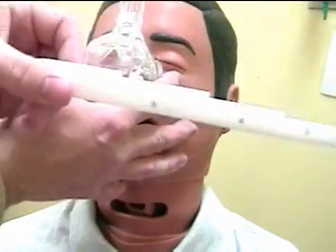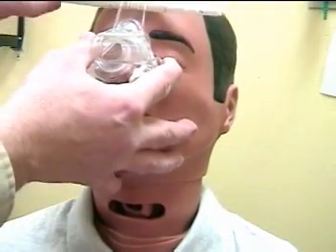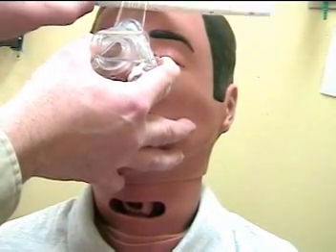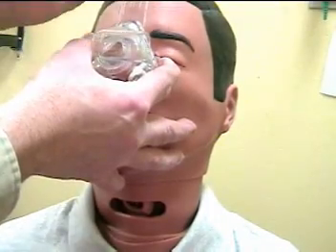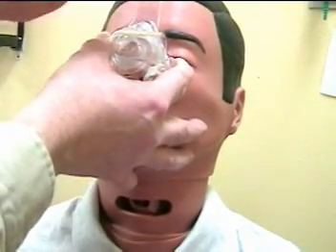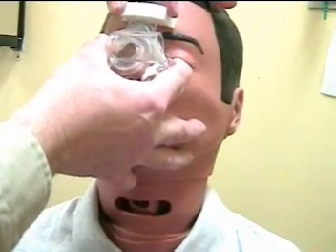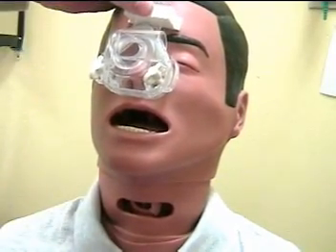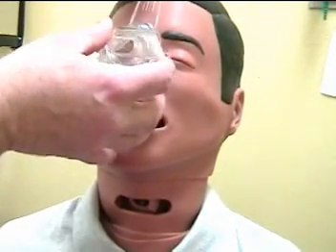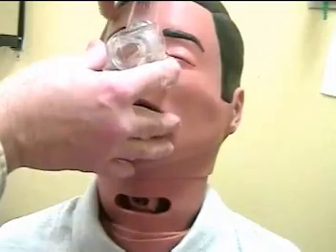This little sizing block helps tell us how far this block should be, and you try and make sure that the mask is level, and then you find which level of the block fits the best, and in this case it's the level 6. That refers to the spacer, and we insert the spacer here to the 6th level, and that holds this nice onto the forehead when we put the head strap on, so that the mask doesn't lift up from the bottom. Without the block it would lift up on the bottom, or if the block's too big it would push away from the top of the head, causing gaps that way.